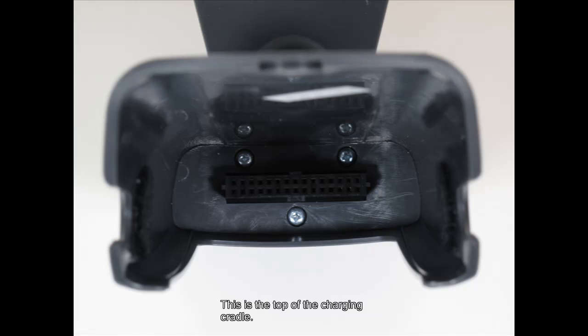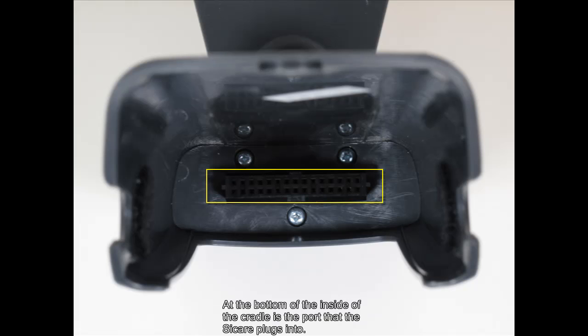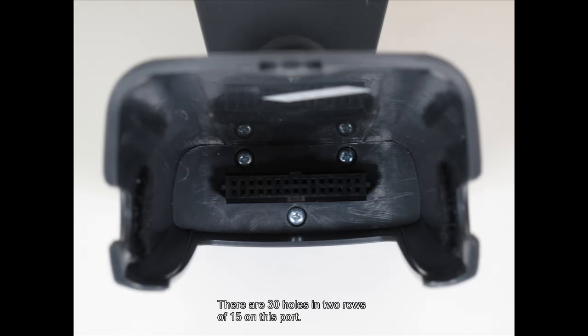This is the top of the charging cradle. At the bottom of the inside of the cradle is the port that the Sicare plugs into. There are 30 holes in 2 rows of 15 on this port. Care must be taken when pressing the Sicare unit into the cradle to not bend these pins inside of the Sicare unit. Now let's see the bottom of the charging cradle.